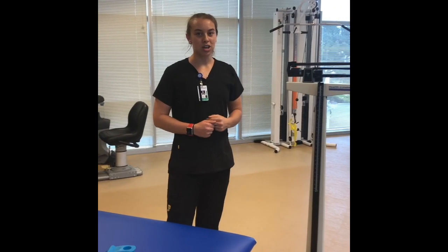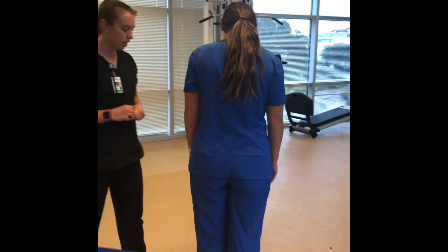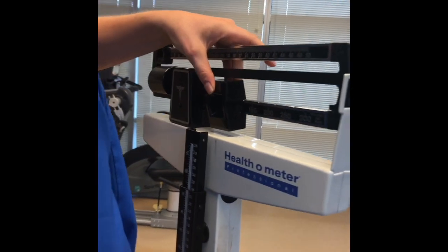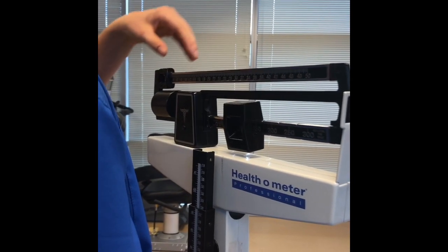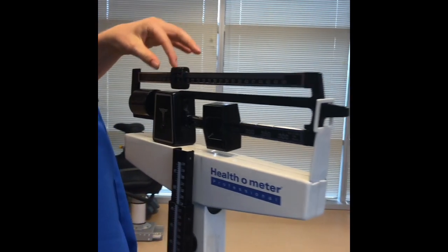Now that the patient's shoes and socks are off, you'll have them stand up on the scale. Make sure both feet are on top of the scale and they are well balanced. Then you are going to move the bottom weight first. So we'll check at 100. You're going to slowly move the top weight until this piece is even in the middle.